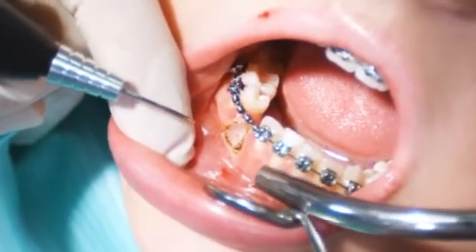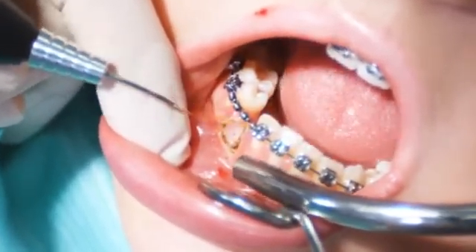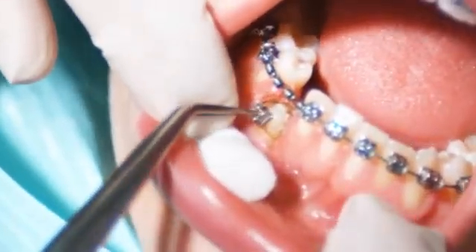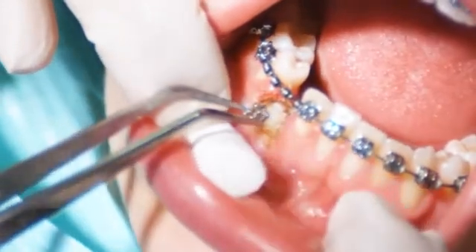After approximately one to two weeks, you will have optimal mucous membrane conditions. Attach the bracket so that the tooth can be moved to its correct position.